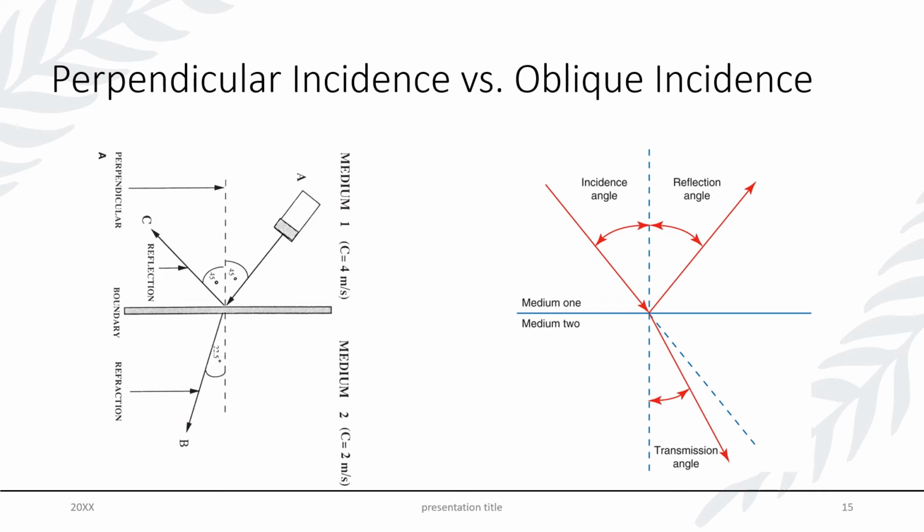Now, another consideration when you're scanning: you're going to get the best echoes back if we do what we call perpendicular incidence. So say this is my transducer, and I was able to send out my sound pulse 90 degrees to a border or to a media change with a change in impedance. That is going to promote the most significant, or the most pure, reflection. So if I hit it at 90 degrees, I should get the greatest echo back.